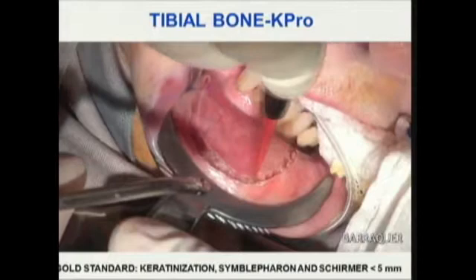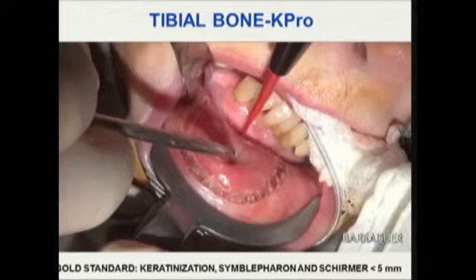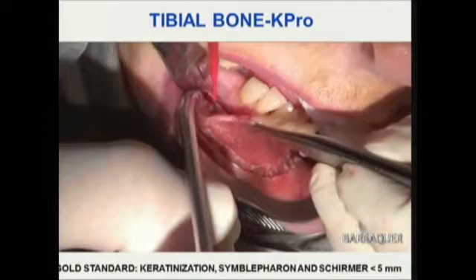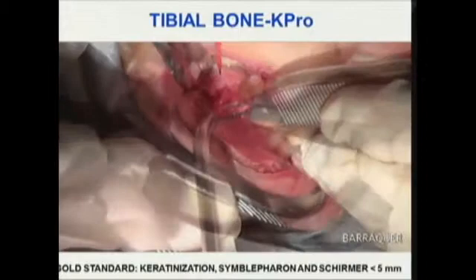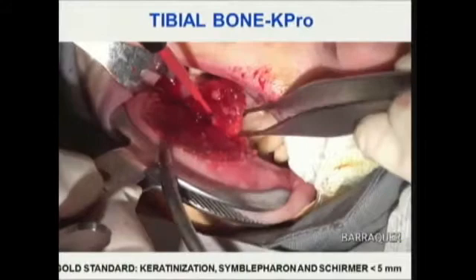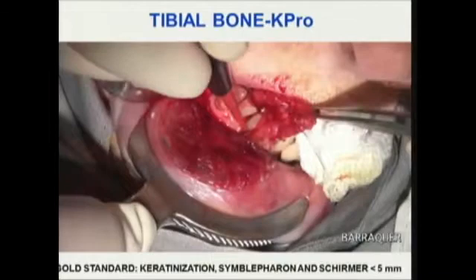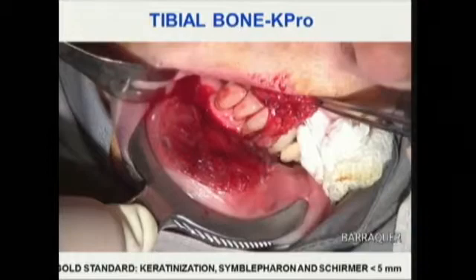After that, we get the oral mucosa graft. The diameter is more or less 3 by 3 centimeters. It's a full thickness oral mucosa graft. We use the Colorado needle with monopolar cautery. We also use this special lip clamp, made by a store 40 years ago. Unfortunately, it has been impossible to find another one.